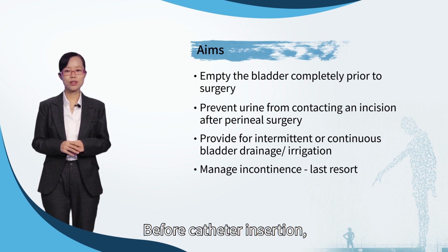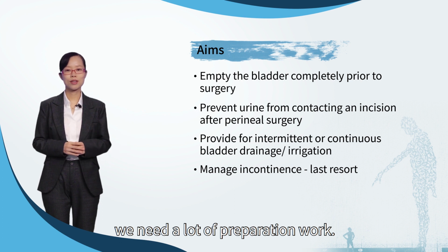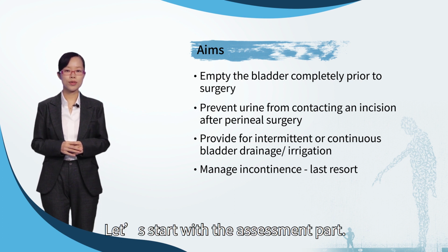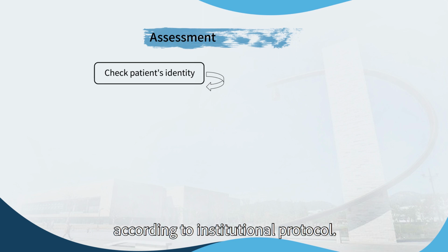Before catheter insertion, we need a lot of preparation work. Let's start with the assessment part. First of all, check the patient's identity according to institutional protocol.